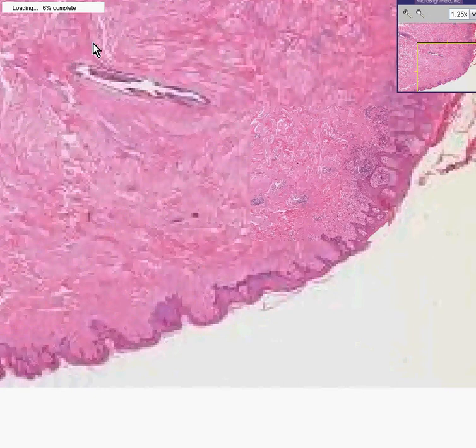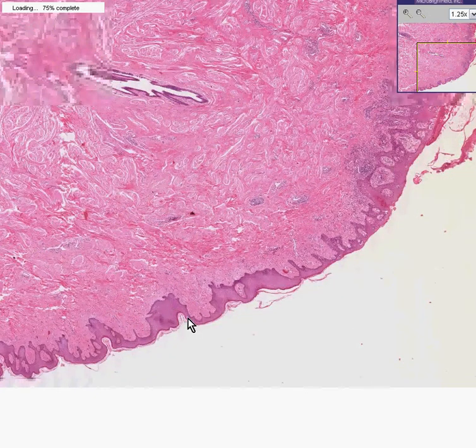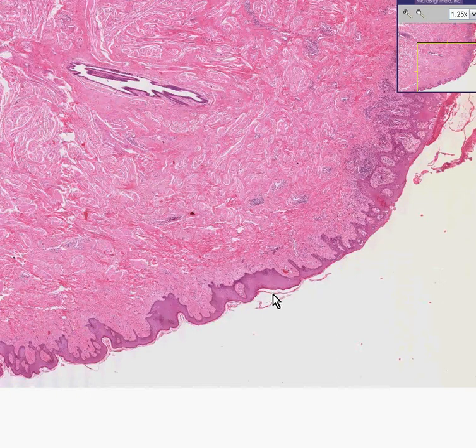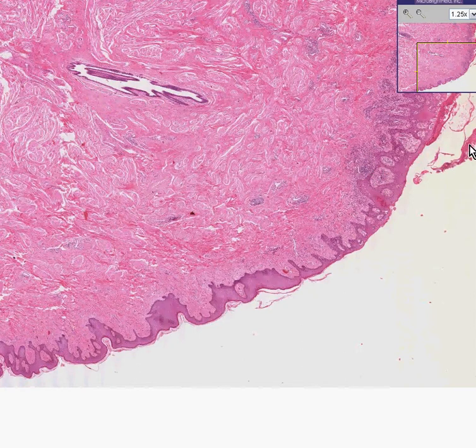Here is a breast. Here is the skin of the breast. Notice there's a stratum corneum. Notice there's the normal maturation of cells from the basal layer to the superficial layers. Notice when you get towards the nipple, however, you see a lot of inflammation and you see some hyperkeratosis as well.